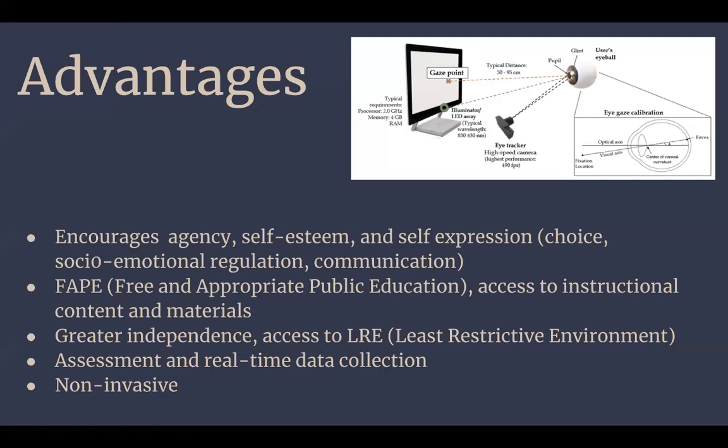Another advantage is that the eye gaze device will aid a free and appropriate public education. So a student will have greater access to the same instructional content and materials as their peers. That greater independence will provide access to the least restrictive environment. A student can receive their adequate education in a wider range of settings. Assessment and real-time data collection is possible.